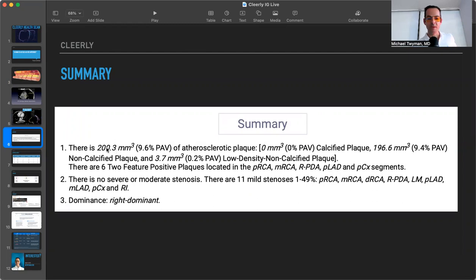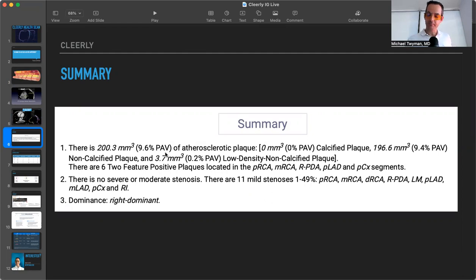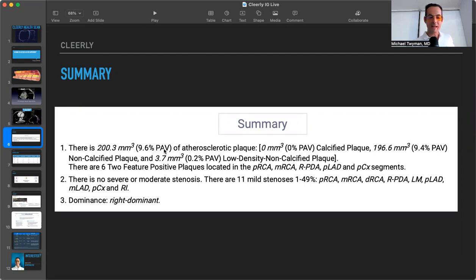But what was really beneficial for the test is giving you the total volume of plaque. So this person had 200 millimeters cubed of plaque volume, or percent atheroma volume is the acronym here. And so that's how much plaque is in the artery walls.